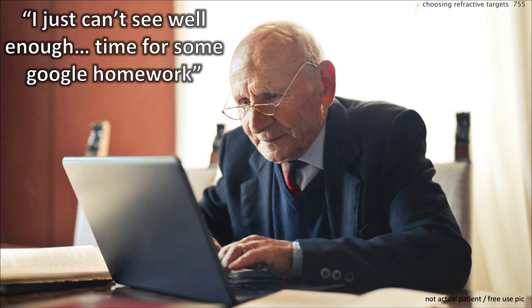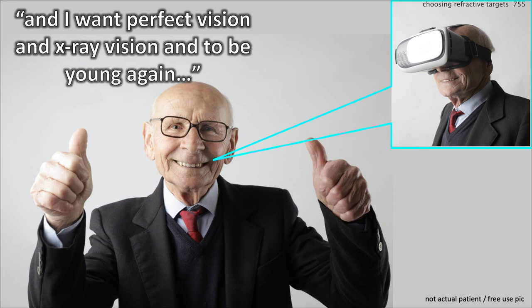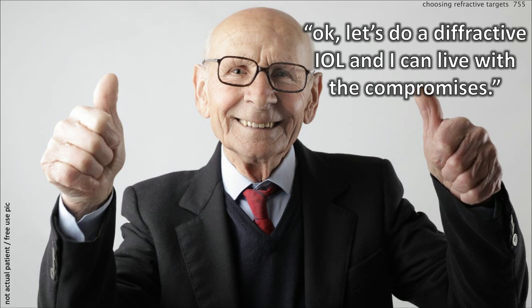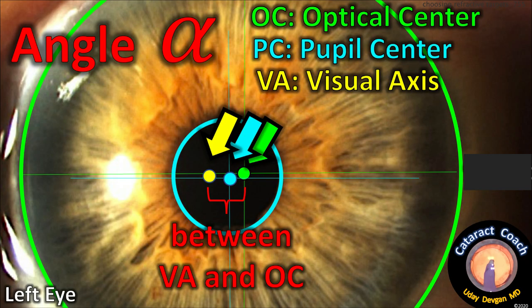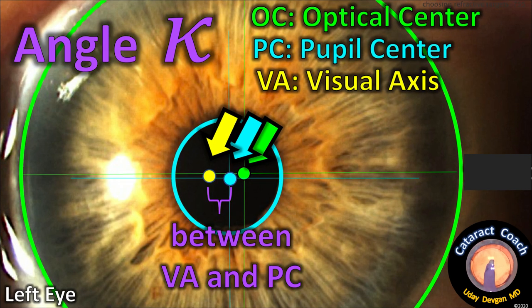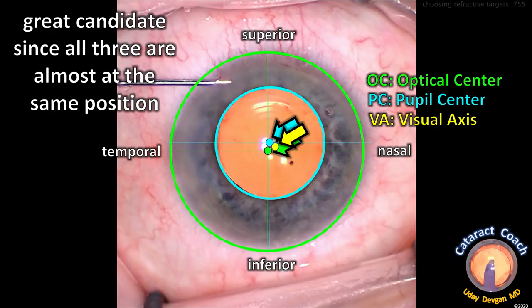Our last patient says he just can't see well enough. After some Google homework, he figures out he can get perfect vision and be young again. He says, I'll pay whatever you want, but I want absolute perfection. So we under-promise, and he agrees to the diffractive trifocal lens and says he can live with the compromises. Important: let's analyze his angle alpha — the distance between the visual axis and the optical center — and even more importantly, angle kappa, the distance between the visual axis and the pupil center. You want those to be almost the same. In this patient, the pupil center and the visual axis are nearly identical, as is the optical center.